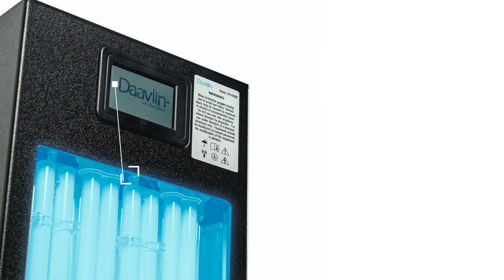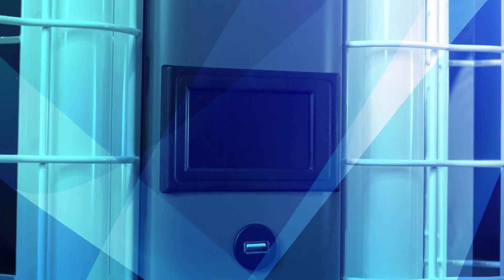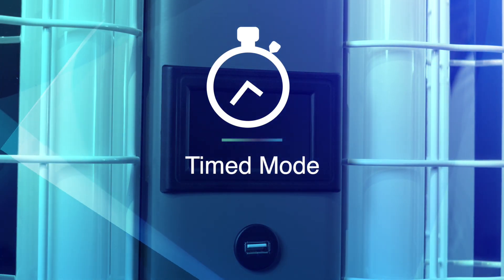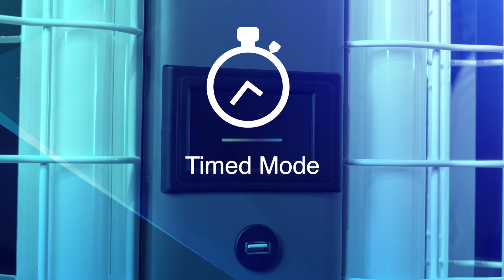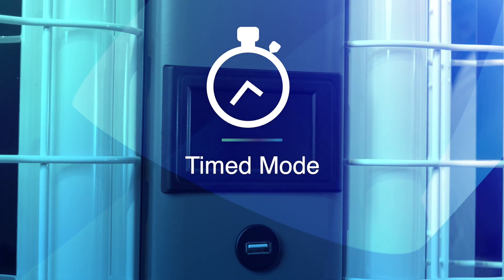The ClearLink system's easy-to-read display allows you to quickly set up a treatment with intuitive, simple-to-follow, on-screen prompts. In this video, we will be discussing the benefits of the timed mode, along with step-by-step instructions on how to begin and progress through a treatment.